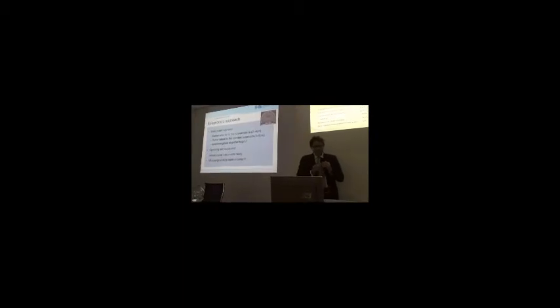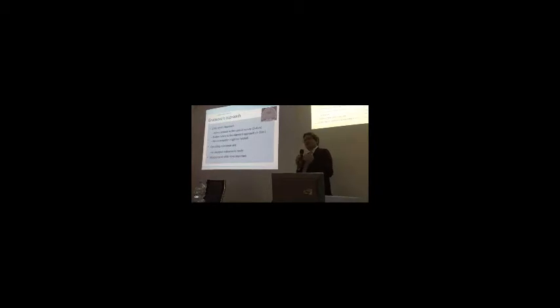Then some say you can stay a little bit anterior to the coronal suture. Some say you stay a lot anterior to the coronal suture. Both approaches have some advantage. I think the most advantage is that the more anterior you come and the more lateral you go, the easier it is to really see the attachment of the colloid cyst at the roof of the third ventricle. And initially, I always said you have the microscope ready. I don't say this anymore, but you have to have the skills to remove this lesion if the endoscopy fails. So microsurgical skills are more important.